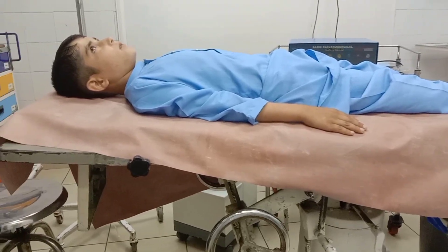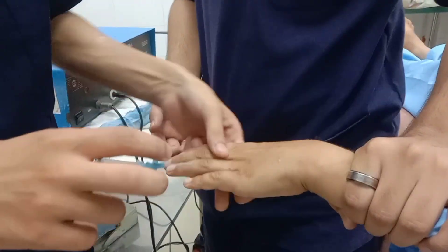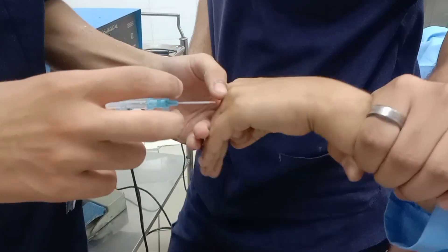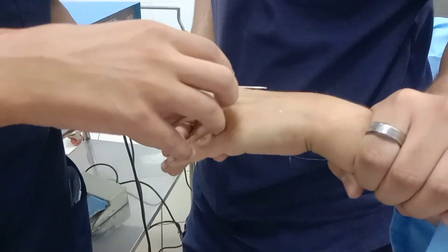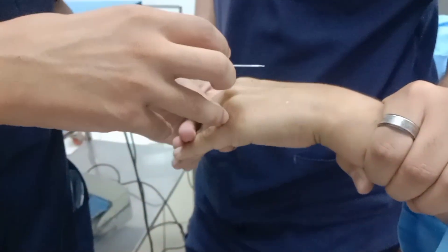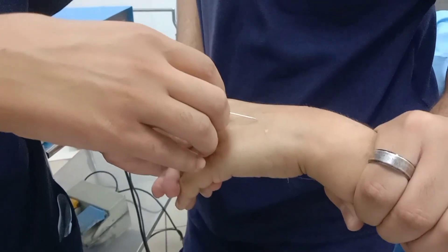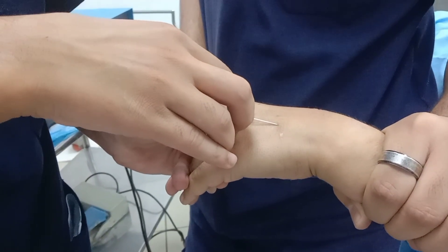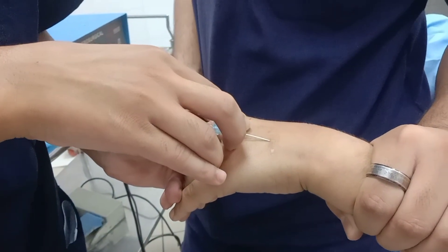The pediatric patient was received in the operation theater and gently transferred onto the operating table in the supine position with proper safety measures. Standard monitors were applied, including ECG leads, pulse oximeter, non-invasive blood pressure cuff, and temperature probe to record baseline vitals.